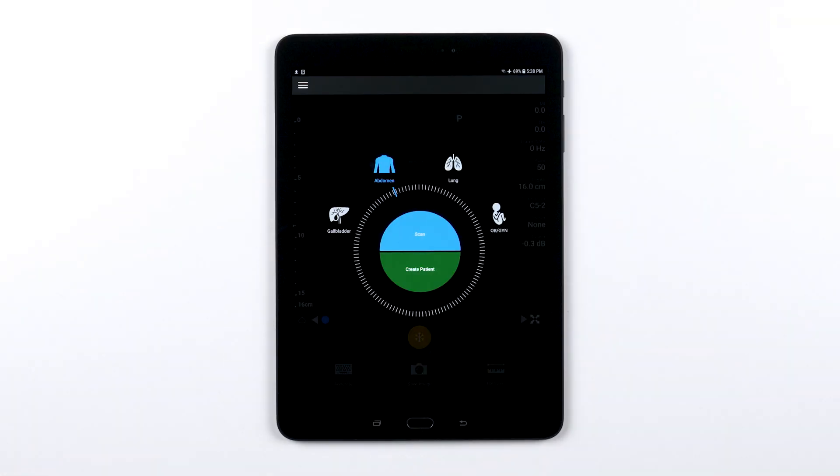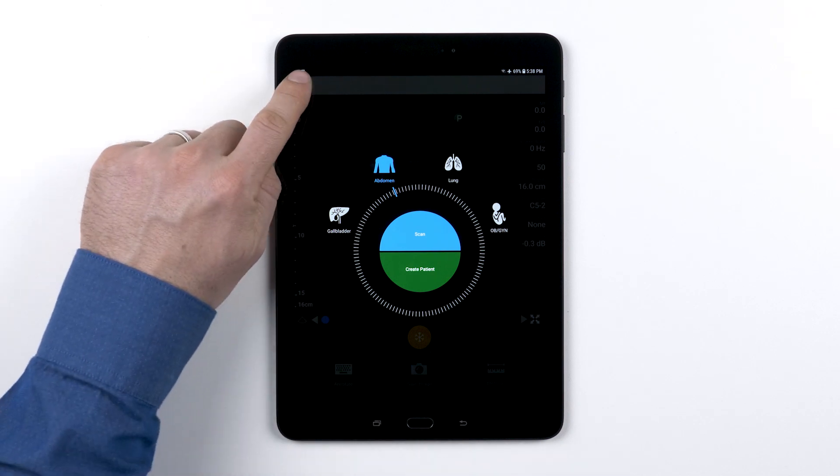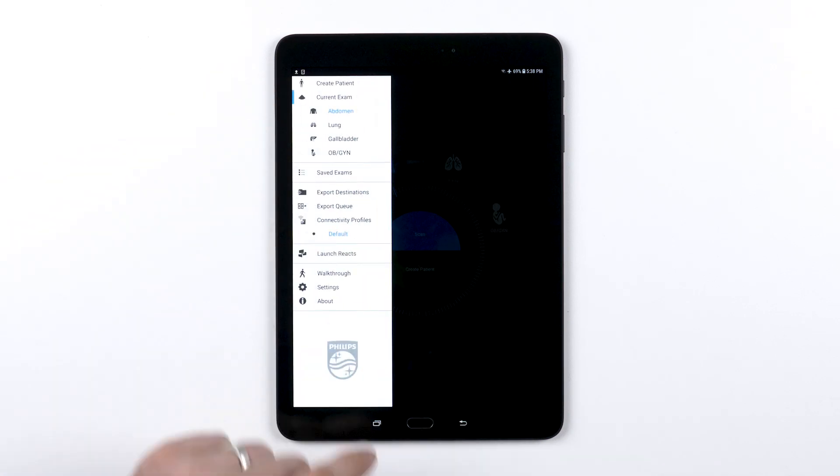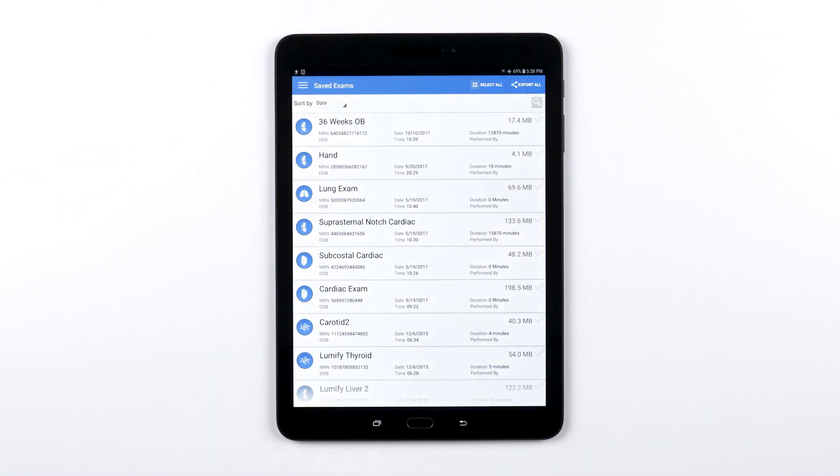In this video we will review how to export exams from your Philips Lumify system. Go to your saved exams and choose the exams or images within an exam that you would like to export.